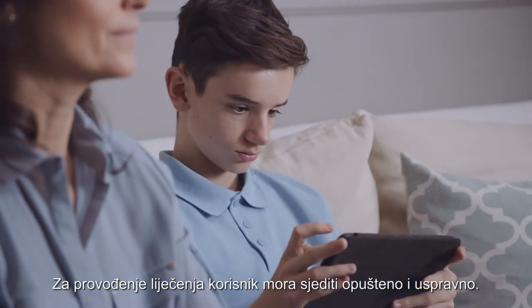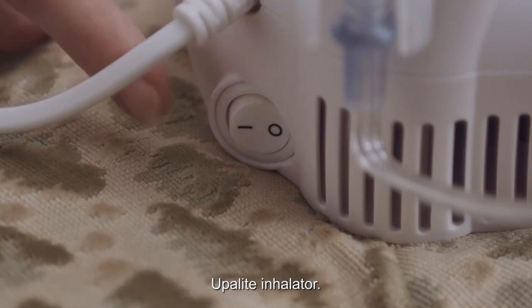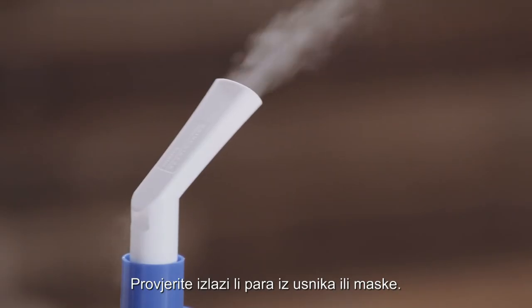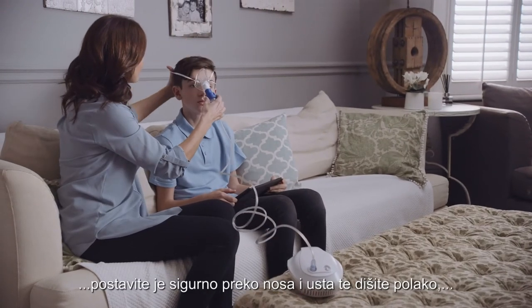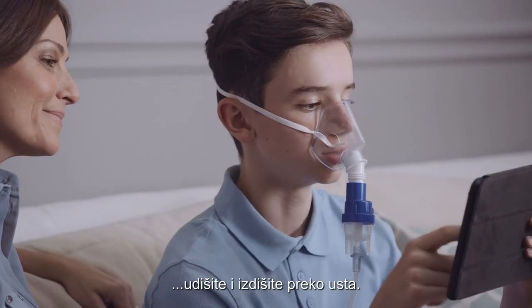To take the treatment, ensure the user is seated in a relaxed upright position and switch on the unit. Make sure mist is visibly coming from the mouthpiece or mask. If using a mask, place it securely in position over the nose and mouth and breathe slowly in and out through the mouth.